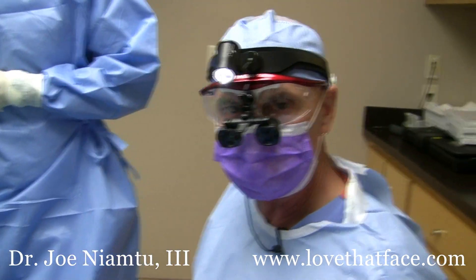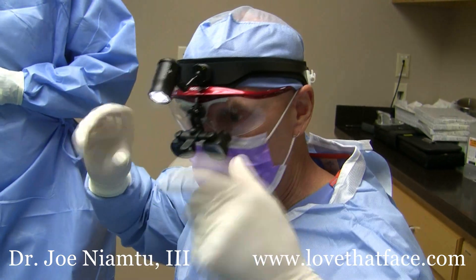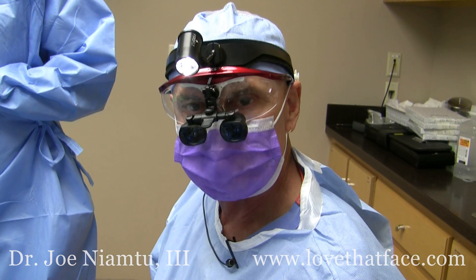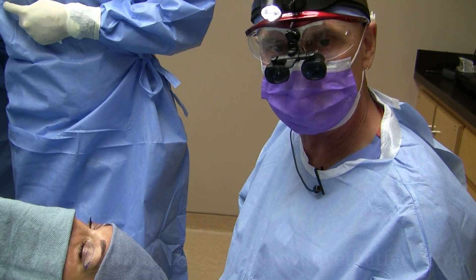For those of you who do surgery, you know that there are many types of headlights that have a big helmet and harness and knobs — and you just don't need all that. So I've been very pleased with this so far, and we're going to continue doing our surgery. I'm Dr. Joe Niamtu, lovethatface.com.